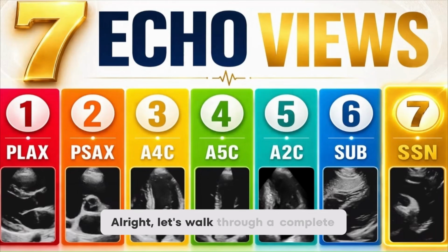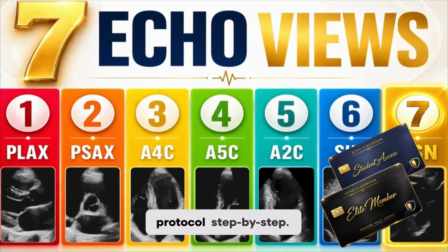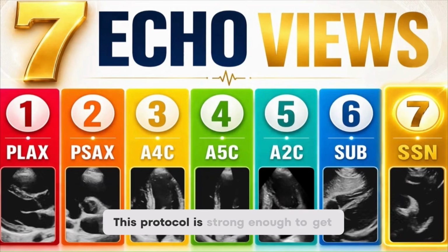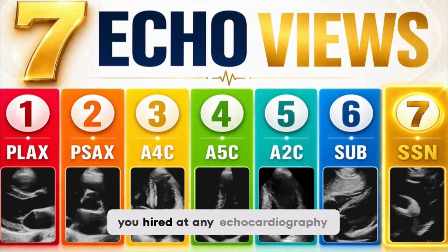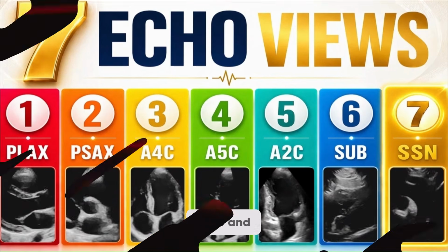Alright, let's walk through a complete transthoracic echocardiogram protocol step by step. This protocol is strong enough to get you hired at any echocardiography lab, including research hospitals in 2026 and beyond.